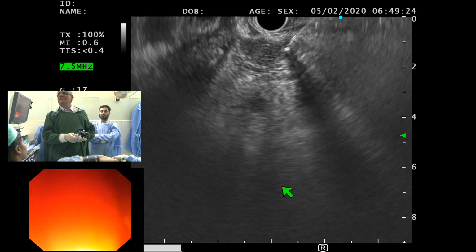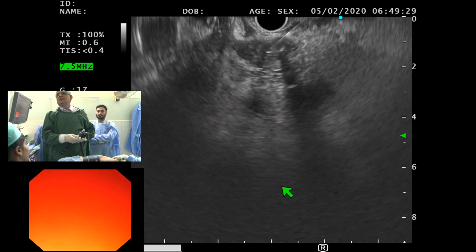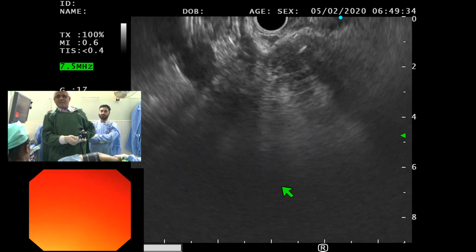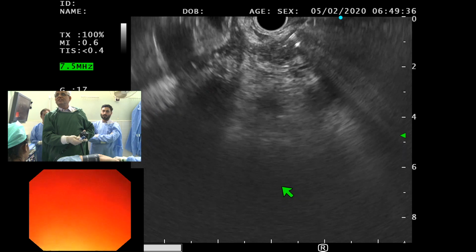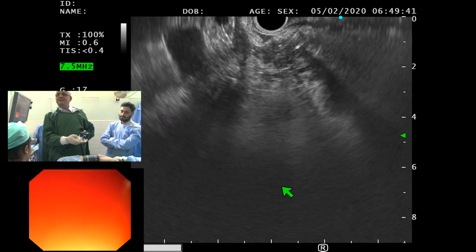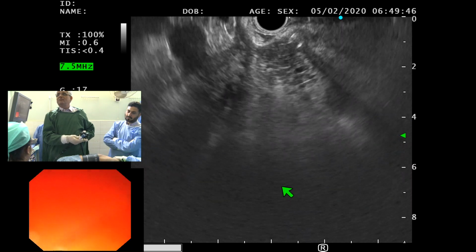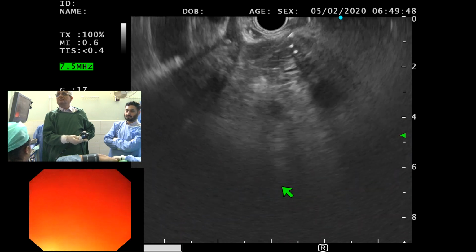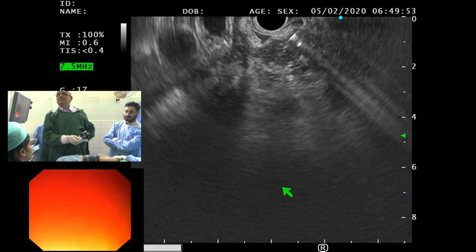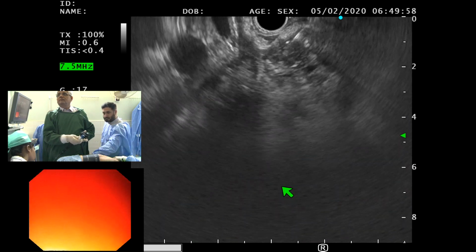See, although we only have like a centimeter here, I'm controlling it. If you look at my hand, we're just jabbing with the thumb and the index finger here, and using my other fingers as kind of a blockage, so it's not going beyond. Can you appreciate that? I don't know if you can. Yes, we can.